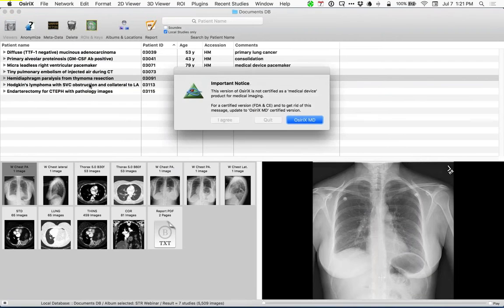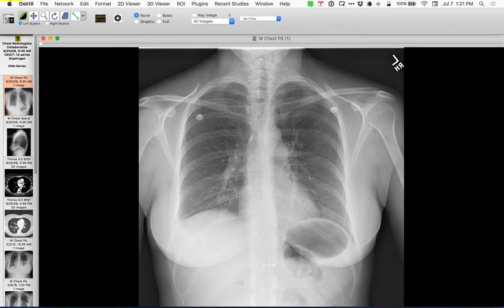Okay. This continues a theme that David really started. Since he started showing us these paralysis cases and to look at the crus, I've been paying more attention to that. We've shown a number of these recently, and sure enough, I came across another really nice example of that.